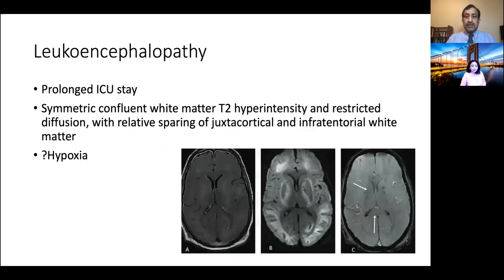Diffuse leukoencephalopathy was a finding seen mostly in patients who had been in the ICU for a long time. As seen in this example, there is confluent FLAIR hyperintensity in the white matter and in the basal ganglia with corresponding restricted diffusion, likely related to hypoxia — representing diffuse hypoxic leukoencephalopathy. This patient also has micro-hemorrhages, with hemorrhages in the basal ganglia and corpus callosum.